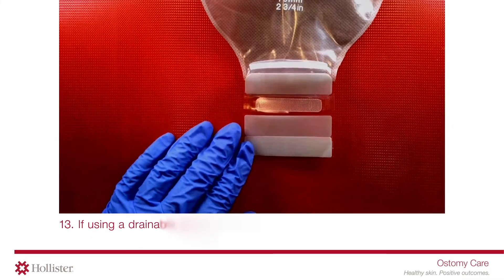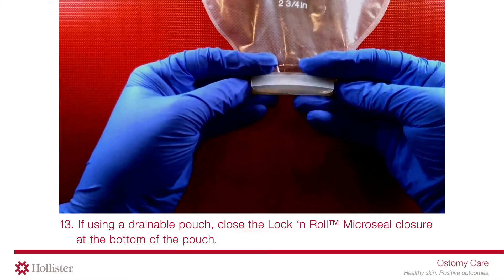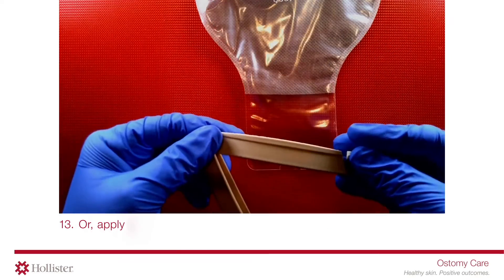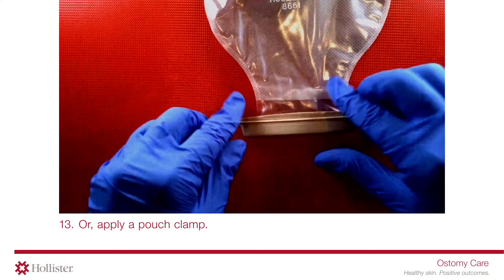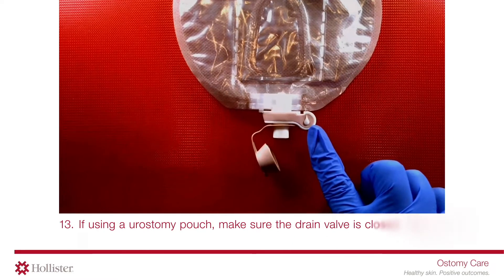If using a drainable pouch, close the lock and roll micro seal closure at the bottom of the pouch. If using a urostomy pouch, make sure the drain valve is closed.